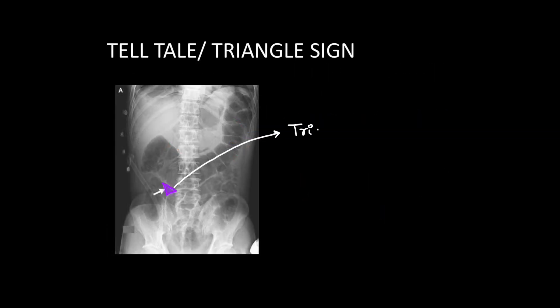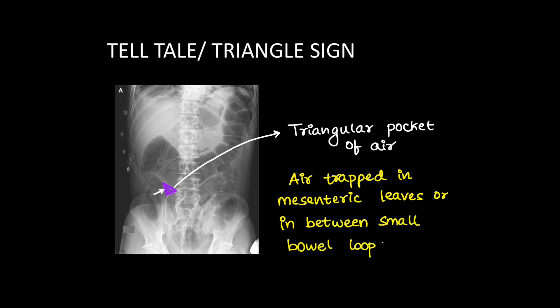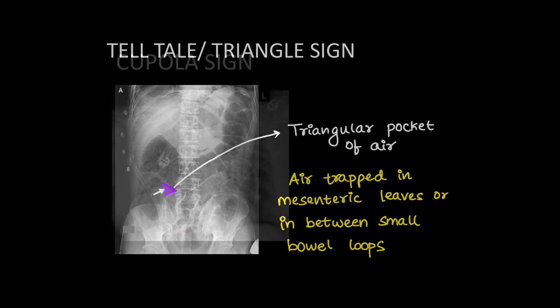Next we have the telltale sign or triangle sign. Here we can see a triangular pocket of air in between the small bowel loops. This is because the free air is trapped between the mesenteric leaves or between the small bowel loops, which appears like a triangle on erect x-ray.